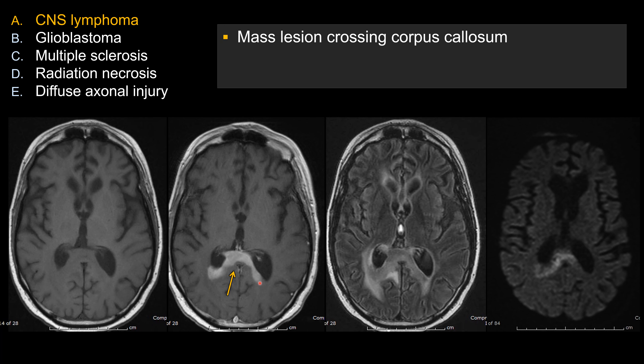There is a mass lesion that crosses the corpus callosum. My top three differential diagnoses for a mass lesion crossing the corpus callosum are CNS Lymphoma, high-grade glioma or GBM, and tumefactive MS or tumefactive demyelinating lesion.